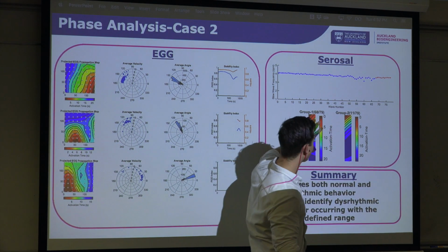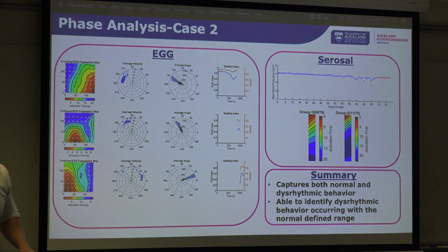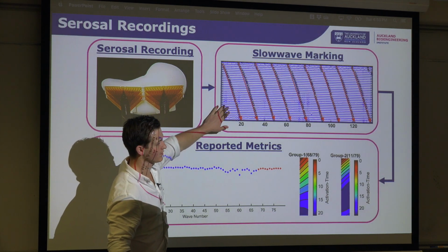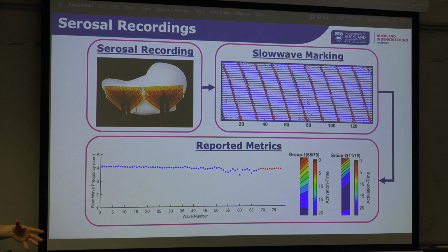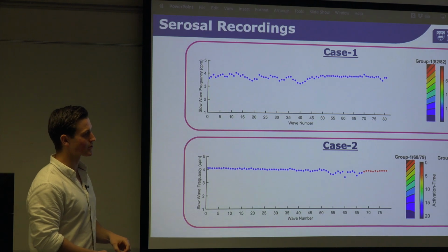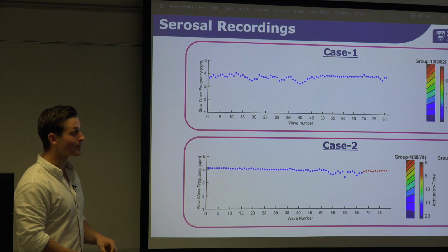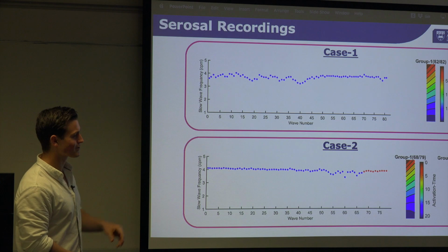It's been classified as normal, but the actual slow wave does not look like this. It's been able to classify it as normal waves, but it's iffy whether it is normal or not. Those two dips were a bit strange as well. A pig's propagation frequency is 4 rather than 3, but for a human it should be about 3 as well. This one was just slightly elevated.